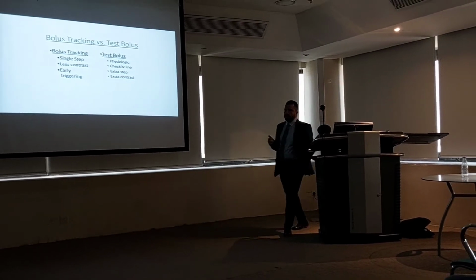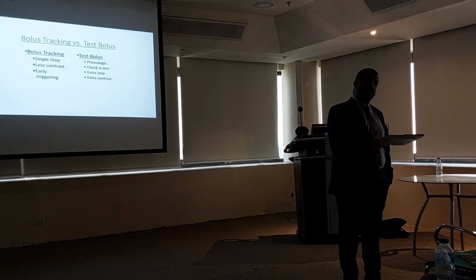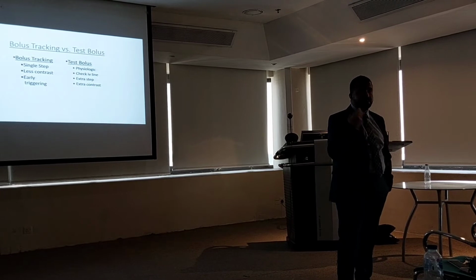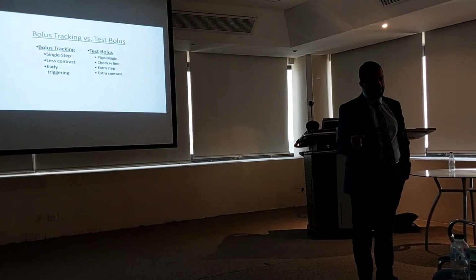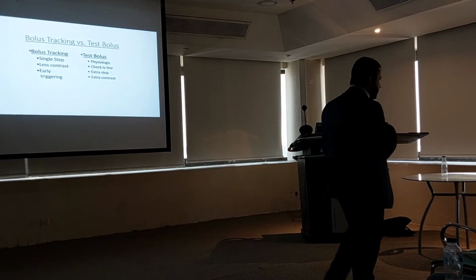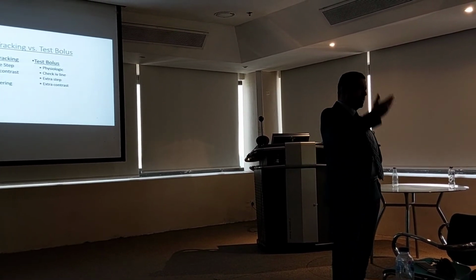The main reason I prefer timing bolus over the SmartPrep is that it involves less human interaction. With SmartPrep, I need to be very accurate in the moment I decide to start. If I start instructing the patient the moment I see enhancement in the aorta, the patient's heart rate will not be the lowest while doing this. So I need to start earlier.